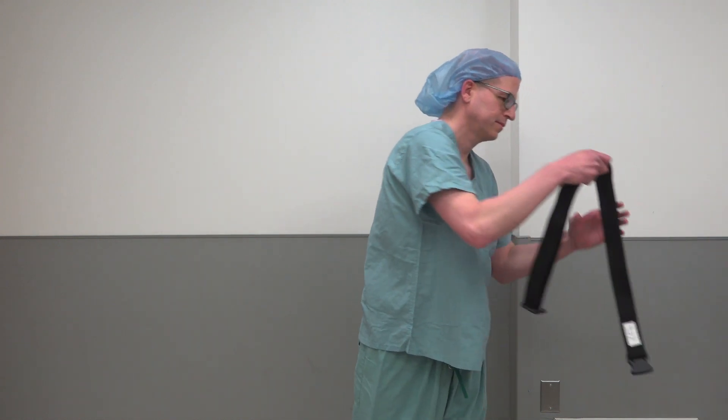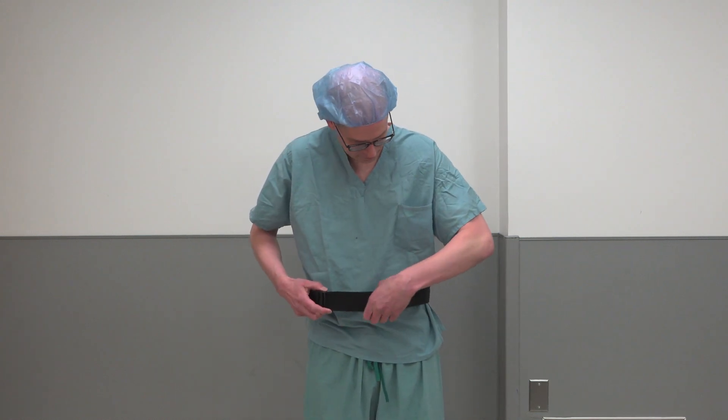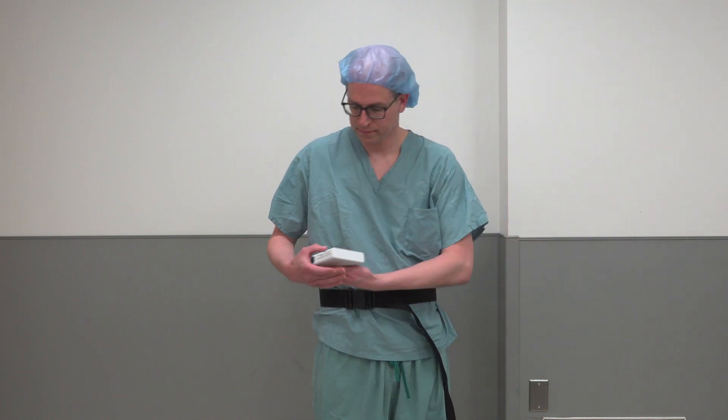Next, we will go through the steps for proper placement of the PAPR device. Note this is done prior to sterile gowning — this is different than non-sterile procedures. First, attach the belt to your waistline.